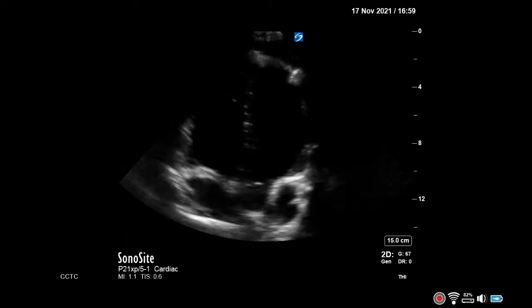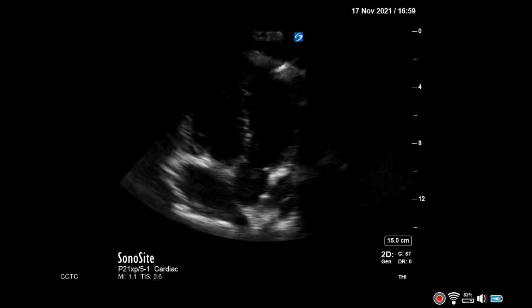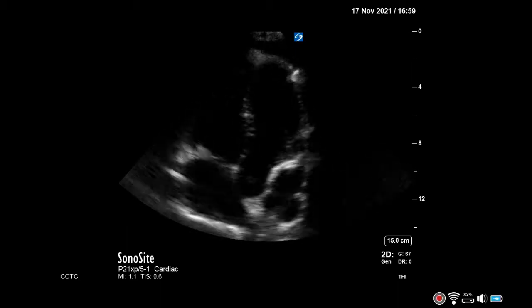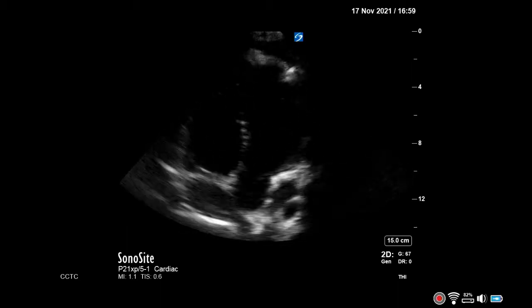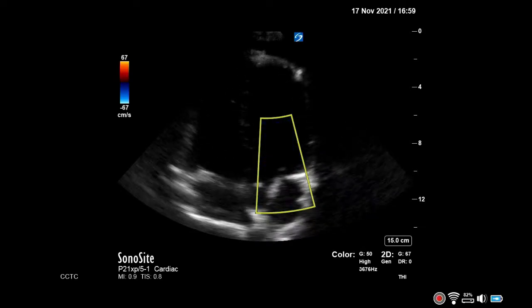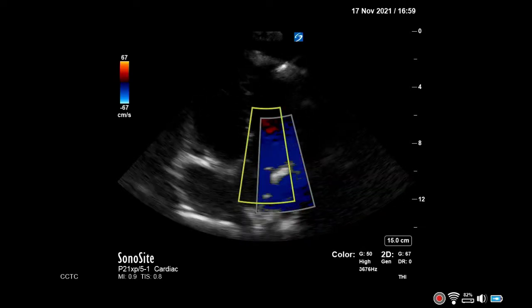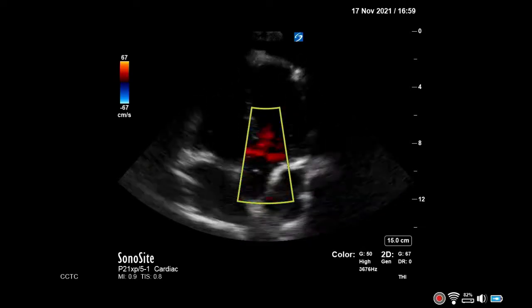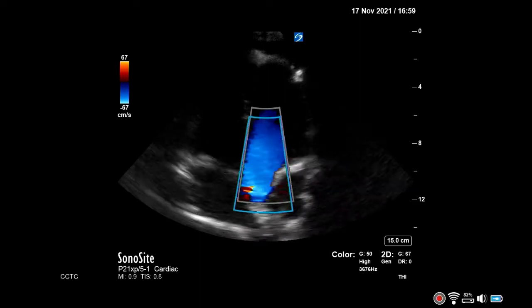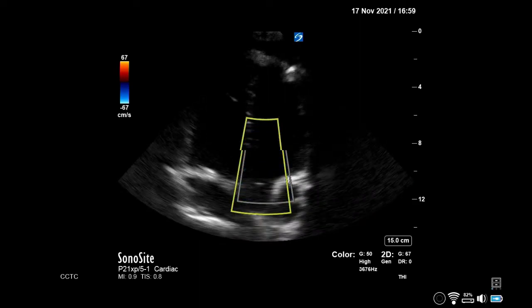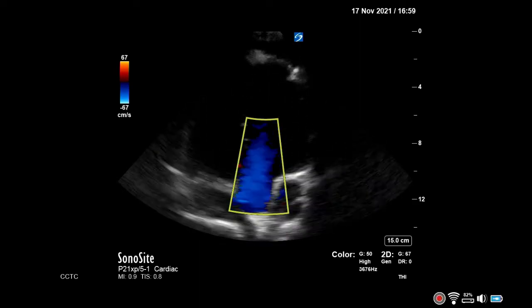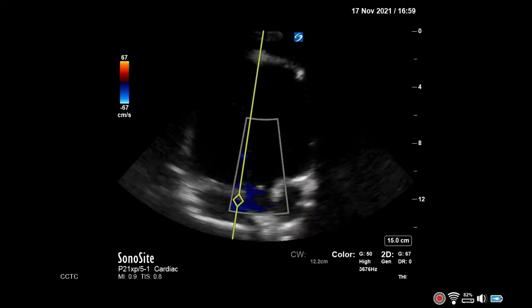Begin in the apical 5-chamber view. Enable color Doppler and place the box over the LVOT, covering the aortic valve. This will allow you to understand the direction of flow.